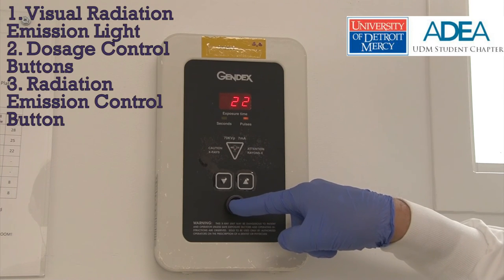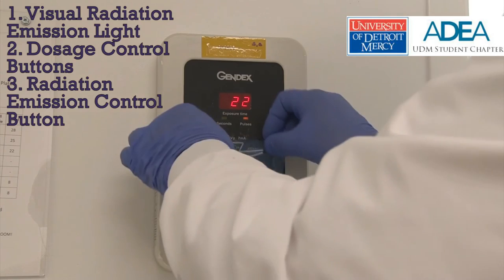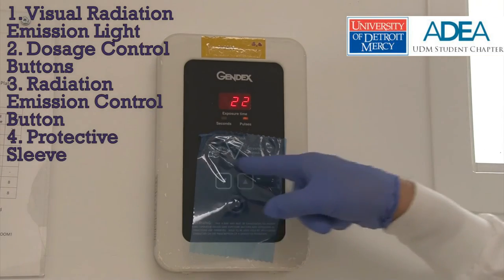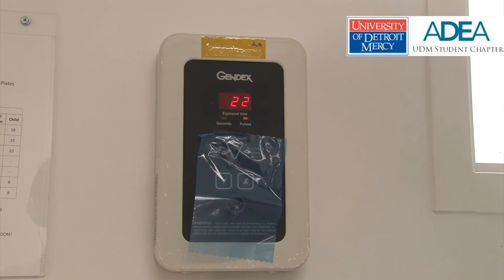You can continue to hold the button until tomorrow. All you will get is a pool of drool. For infection control, the panel is covered by a protective sleeve. The operator is directed only to touch the controls through the blue sleeve, protecting the rest of the surface from contamination.